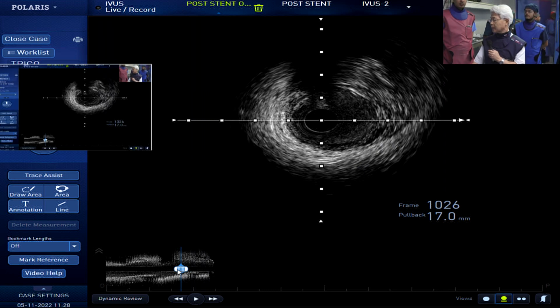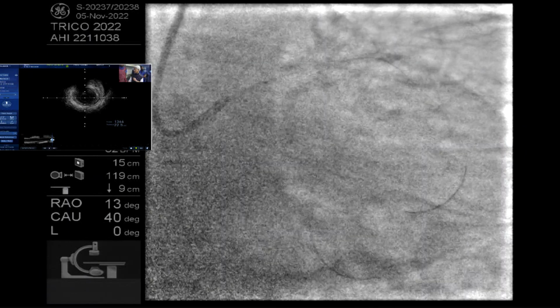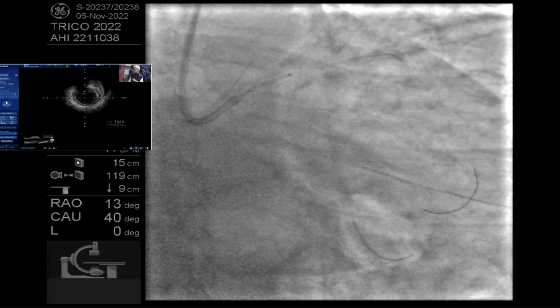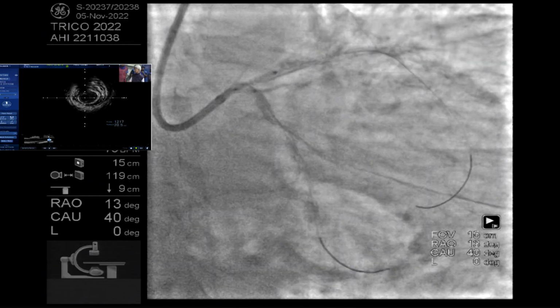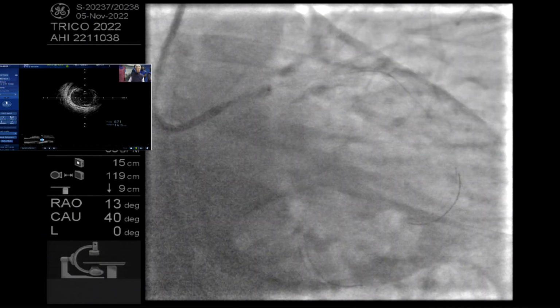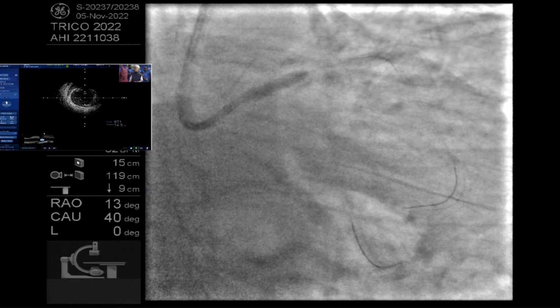Cine, just a moment. Okay, here. A little bit more distal. Here. Oh, that's perfect. Go. Okay, go to 15, 16. 16. Okay, deflate.